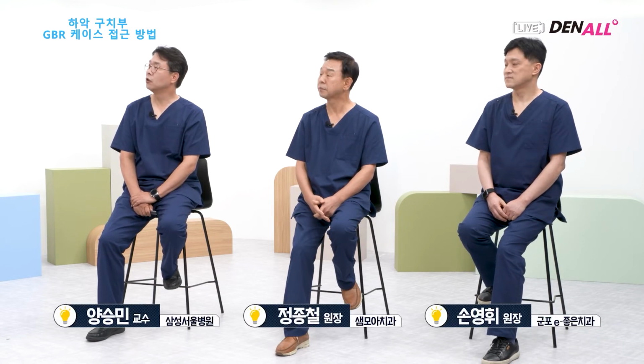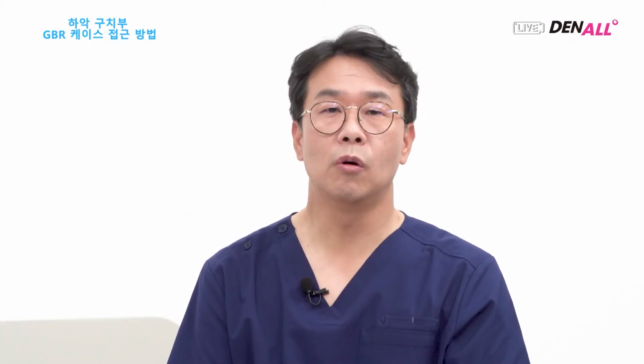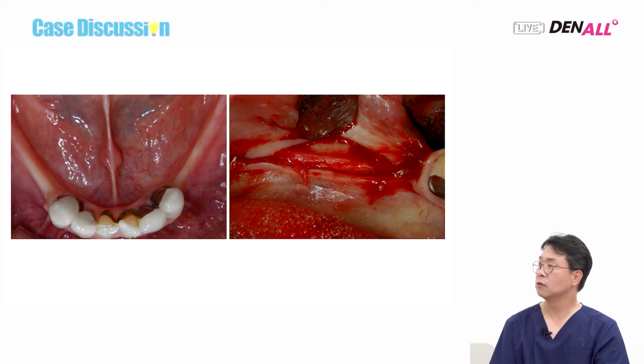Let me go first. In this patient, she's a female in the 30s. But I see a lot of old patients who have worn partial denture for a long time. So many of them are in the 50s and 60s. As you can see, edentulous areas bilaterally and bone width is knife edge. If you open the flap, the base is broad and the top portion is knife edge. I frequently use a lot of GBR.